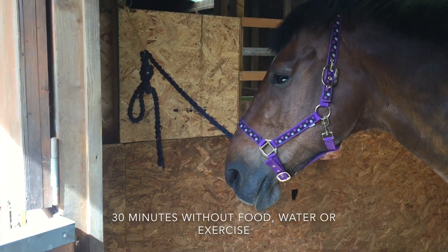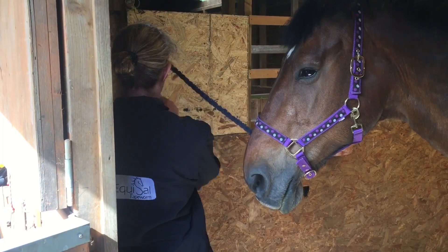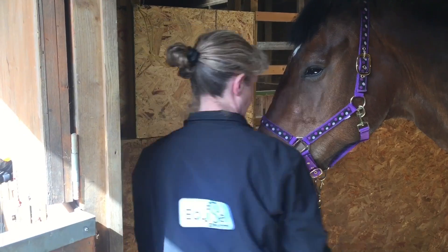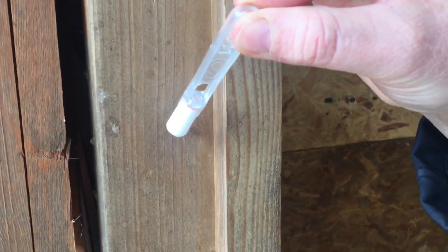Amma has been tied up in the stable for 30 minutes without access to food or water, ensuring she can't reach anything on the floor. A stable is not necessary though, as sampling outside is just as easy.